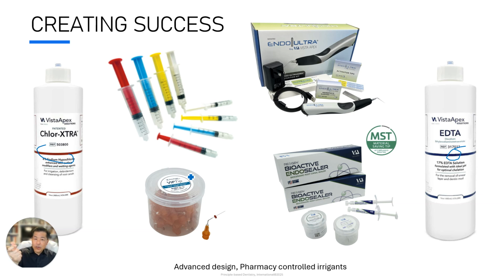I wasn't shaking or worried about jamming it up into the apical end of the root canal system and expressing any of the sodium hypochlorite out the apex. So with the dual side port, we shouldn't be doing that. I take that VIP tip, put it into the bottom of the canal, gently express without binding at the apex of the canal, and I gently express out my Chlor Extra, my EDTA, whichever one I'm using.